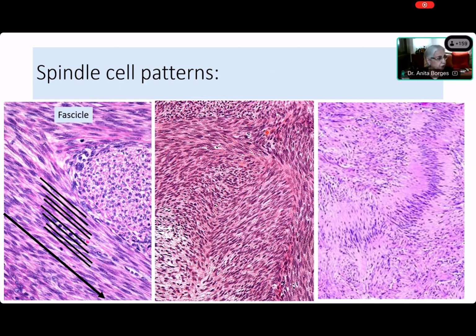Right. So Diksha, you can do an annotation, right? Yes, ask for an annotation, and please show everybody where is this herringbone spine. Have you asked for an annotation? Yes, ma'am. I've received it. Okay, come on, show me.